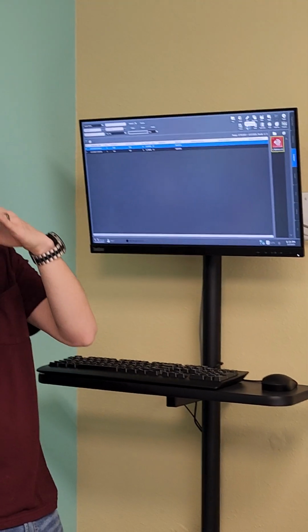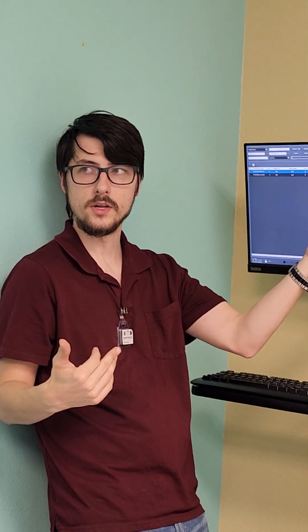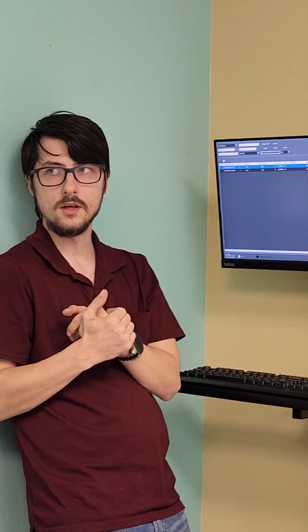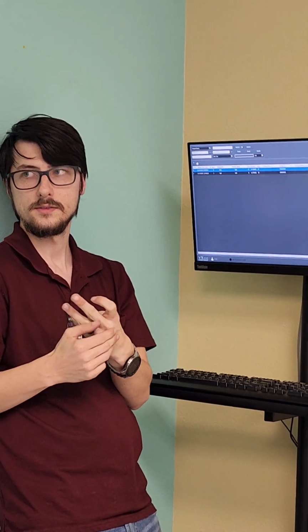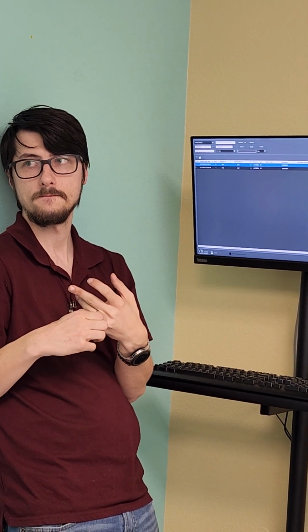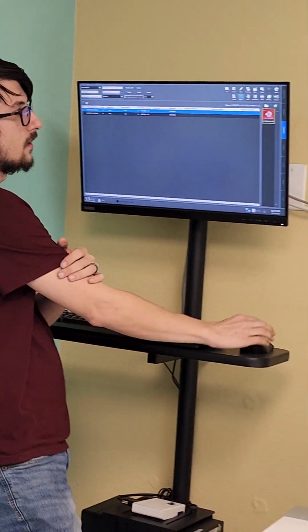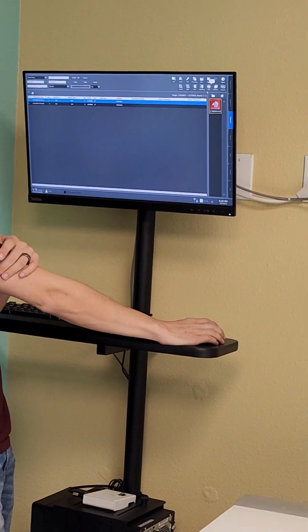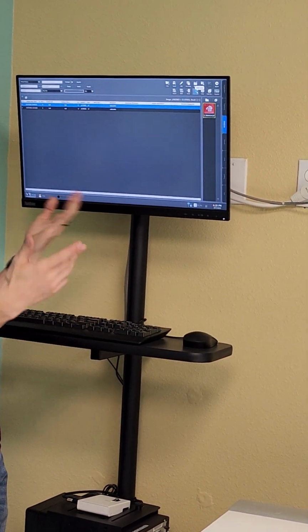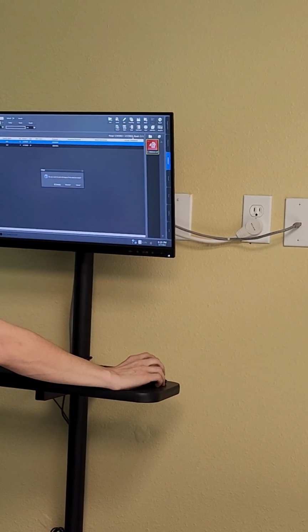Multi-send, you can choose where to send it. Right now I only have it set up for SmartPACS, which is the one in there. I'm not sure if y'all have other ones. It would only be our radiologist for our referrals occasionally, which I think we can send through the online portal anyways. Then yeah, print is printing them, but you don't have a printer attached, but I think it'll still save it as a PDF or something like that.